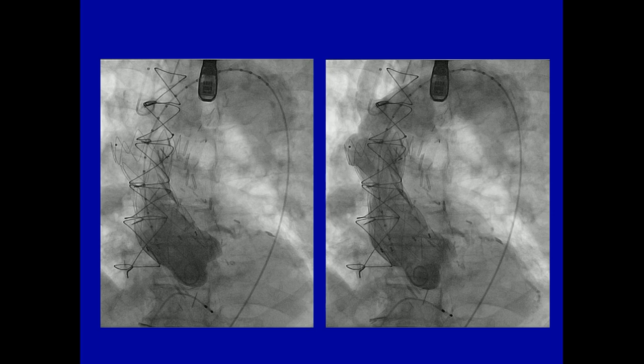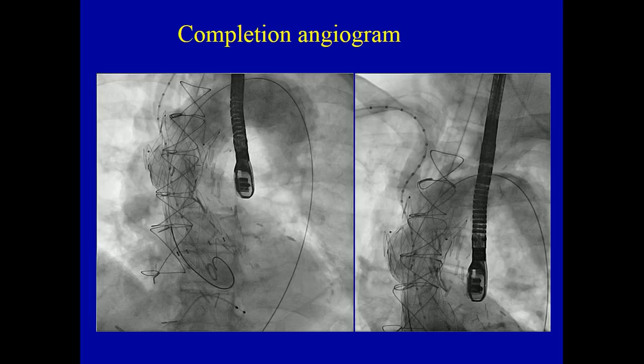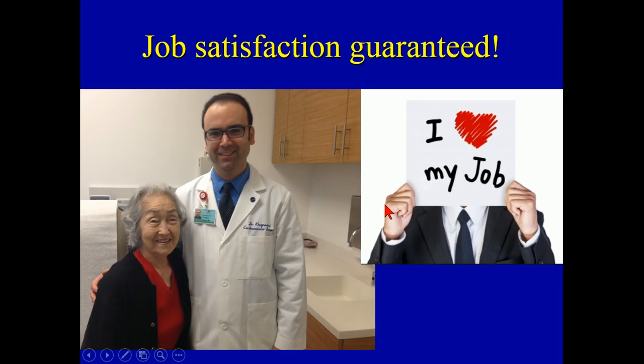As you see, in these cases when you have the stent graft very close to the aortic valve, despite your best RV pacing maneuvers, there is a possibility of that stent, in this case the bare stent, involving the aortic valve. Now the second stent graft was subsequently deployed to cover a distal landing zone. And you see the pigtail, for example, in this case coming from the innominate artery for the angiogram, showing that there's complete opening of the innominate artery. And this is one of our patients.